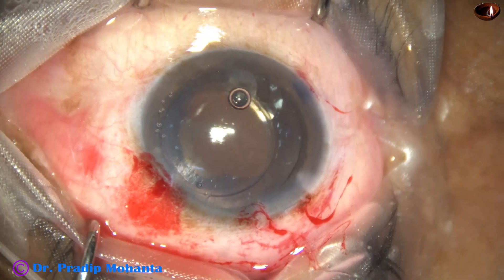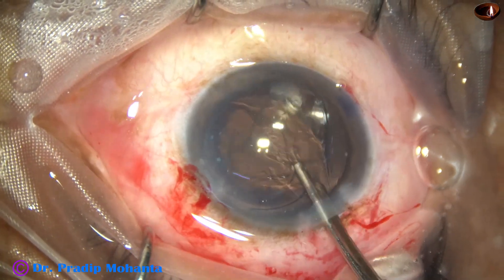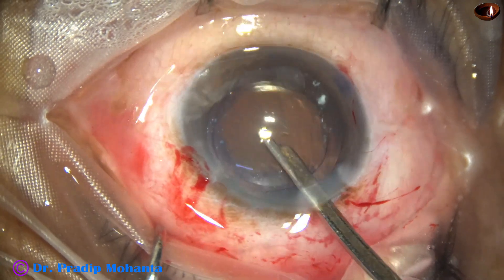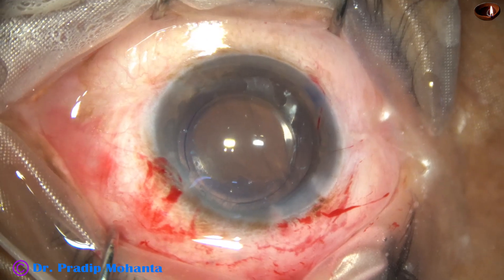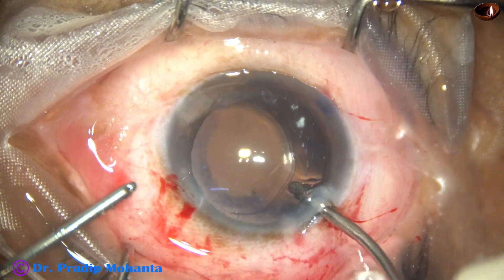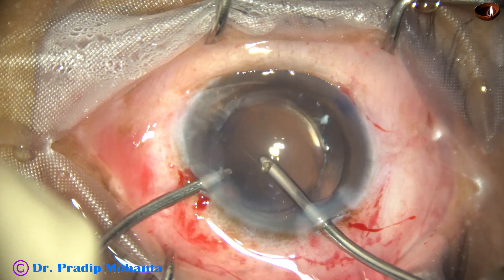Now is the time to remove the visco and conclude the case. There is no cortex in this case — all the cortex has been liquefied and aspirated at the beginning of the surgery, before doing the capsular rhexis, just after making a puncture at the central portion of the capsule. Remember that in hypermature Morgagnian cataract, we can aspirate the milky fluid without doing a small rhexis. But in intumescent cataract, we have to do a mini rhexis, because if we don't, the tear may extend immediately.